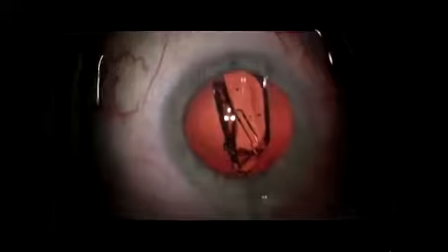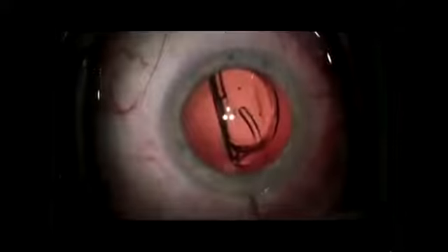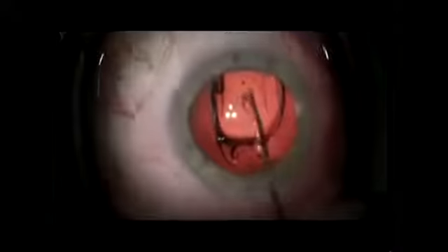You need for this procedure the iTrack microcatheter, Healon GV for the microcatheter, and to put under the gonio lens. I use a 20 gauge MVR blade, which I will demonstrate. Smooth jaws intraocular forceps, loop forceps to handle the microcatheter without damaging it, and also a routine Lester lens rotator. This is the 20 gauge MVR blade.